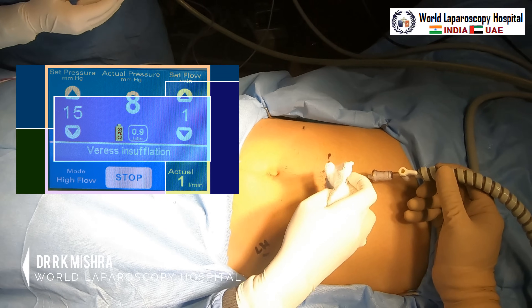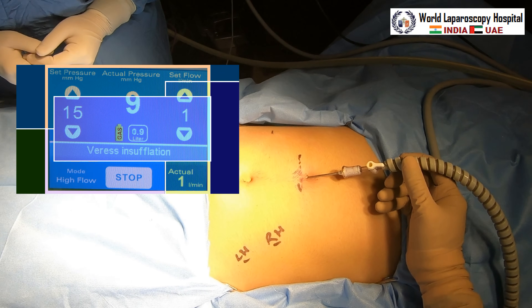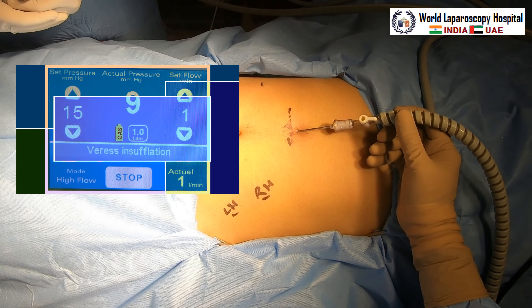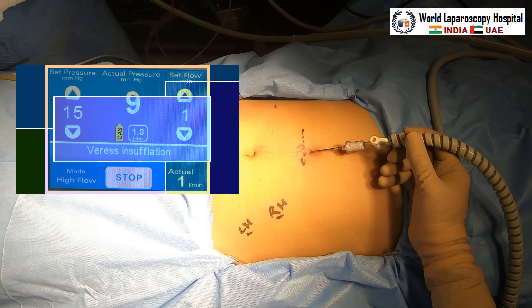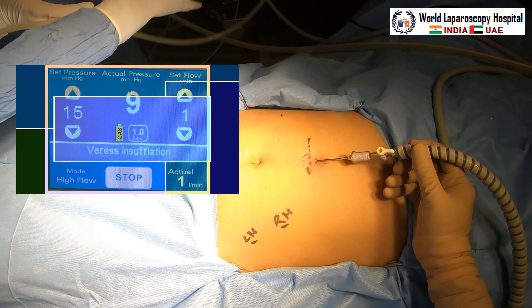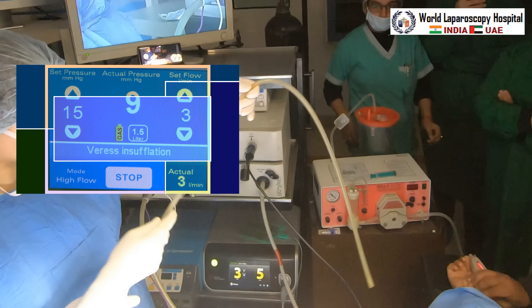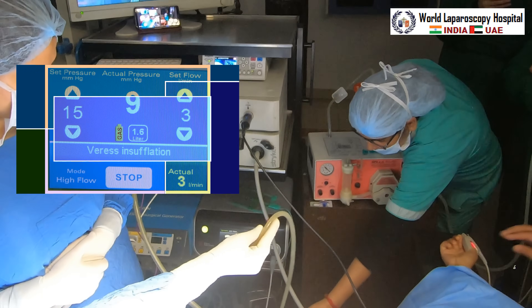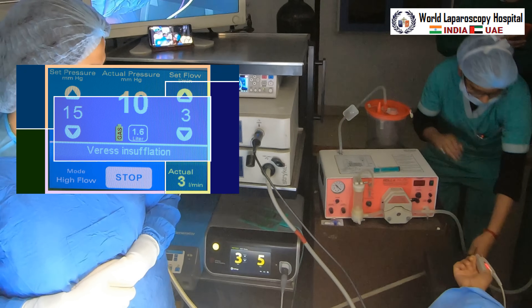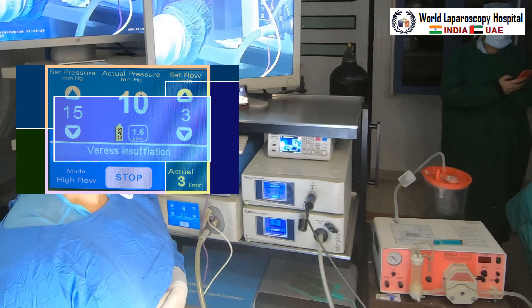This is very good because initially, for the first few minutes, the actual pressure should always be single-digit — that means the gas is going into the abdominal cavity. If within five minutes you go double-digit, that means you are not in the abdominal cavity; you are in the preperitoneum. If it stops immediately at the start, that means you are in the rectus. We can see actual pressure is now 10.